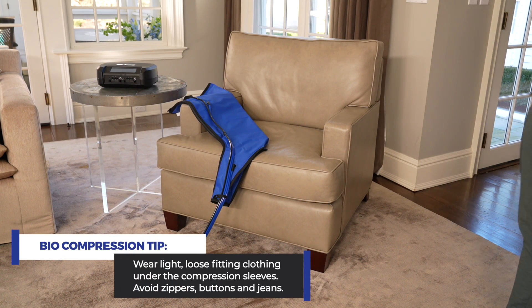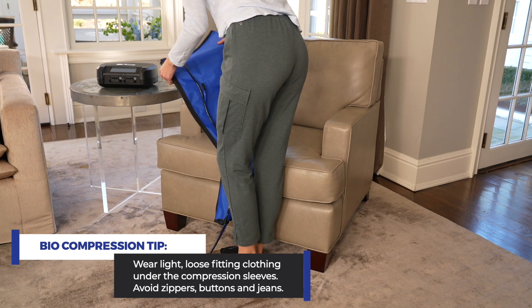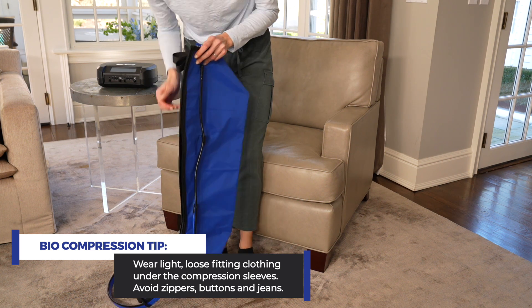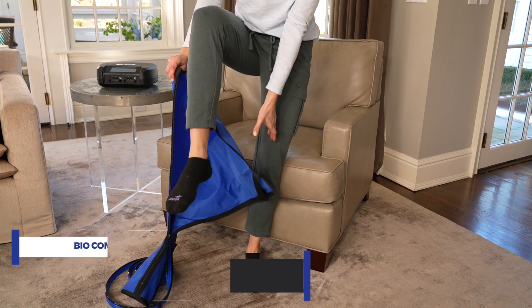Wear light, loose fitting clothing under the compression sleeves. This is both hygienic and will avoid irritation. Clothing should be free of zippers, buttons, or other items that could rub or chafe the skin or damage the sleeves. Avoid wearing jeans or constricting clothing.